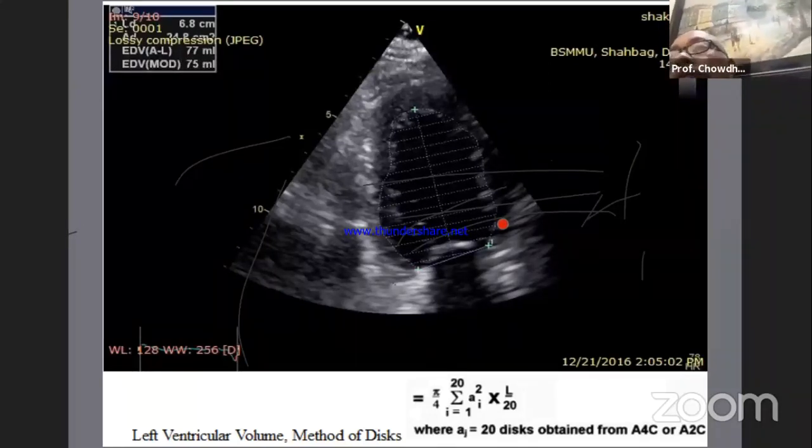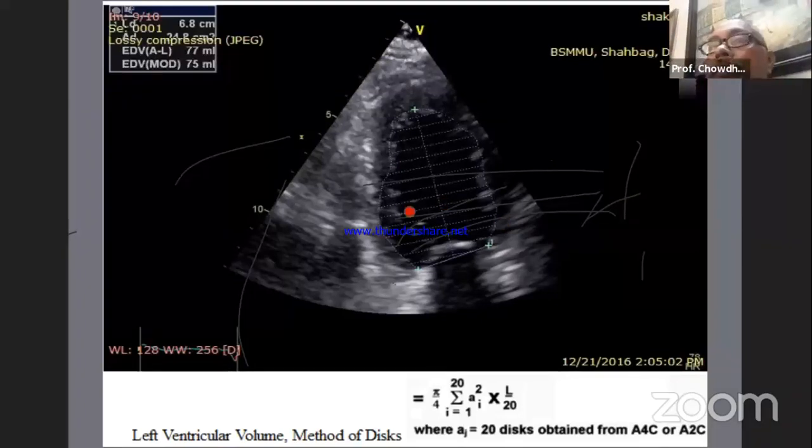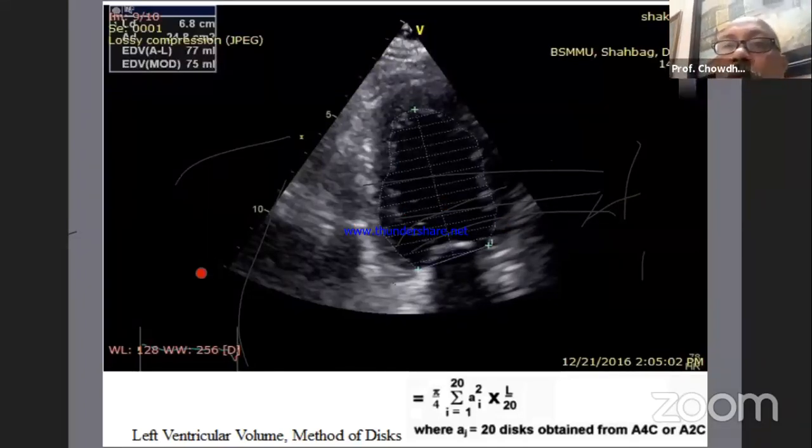measure for systole. So the maximum left ventricular frame and the minimum left ventricular frame are the frames that we should take as the surrogate for diastole and systole. So these are the things that we should practice again and again, so that we will be a little confident to show it to other people, as Professor Tuhin Haq did in one conference. There are other methods of assessing left ventricular function.